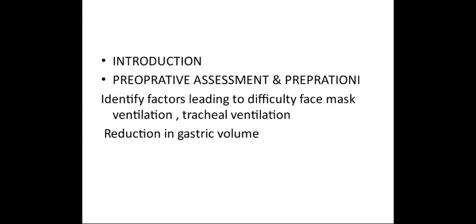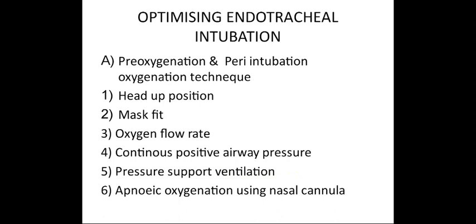Then we will see optimizing endotracheal intubation. How will you optimize? Pre-oxygenation and peri-intubation oxygenation technique. Number 1, the optimal pre-oxygenation increases non-hypoxic apnea time.